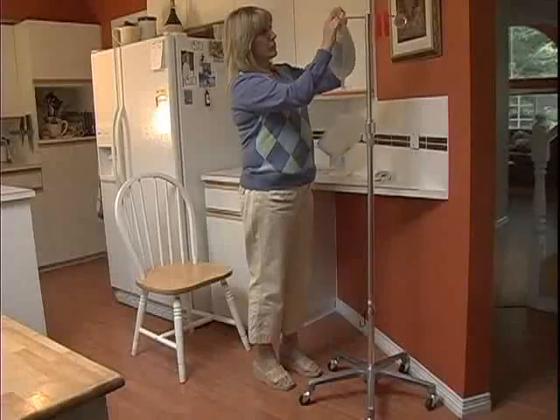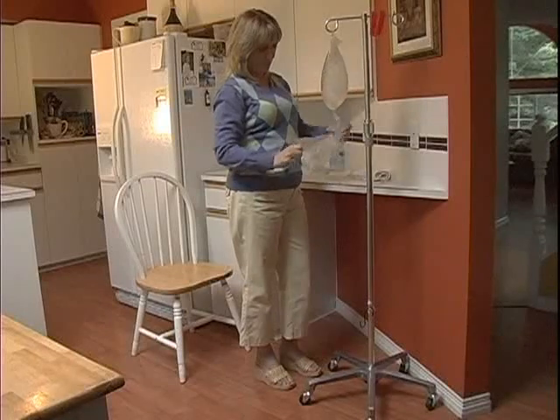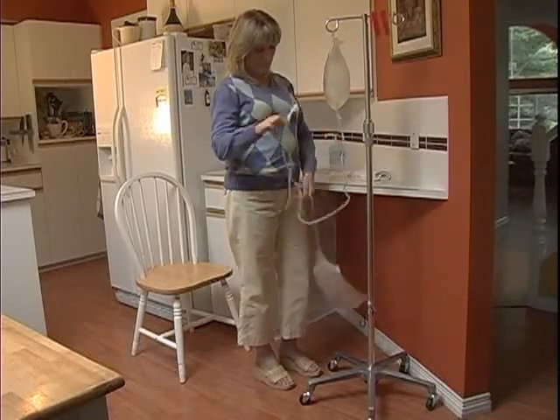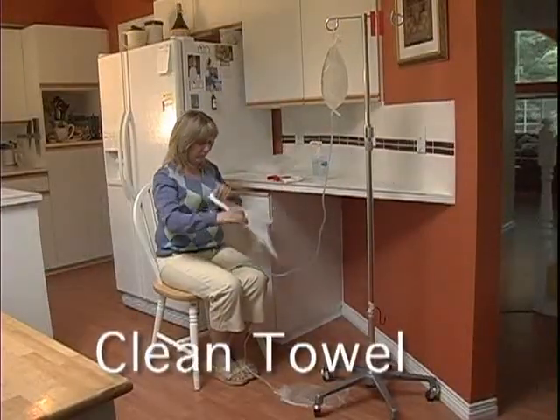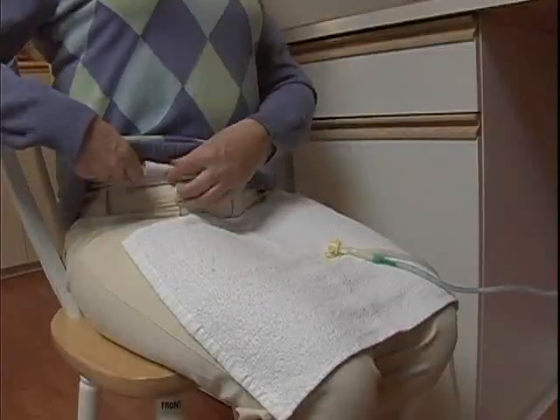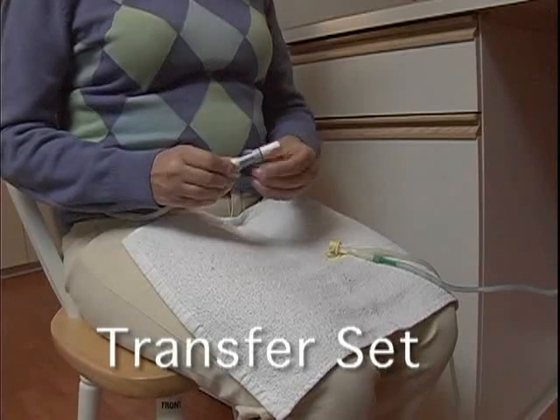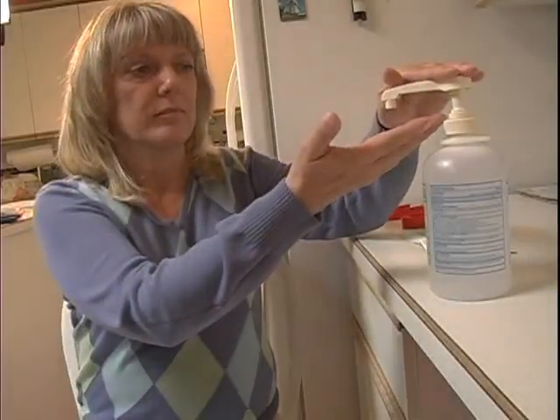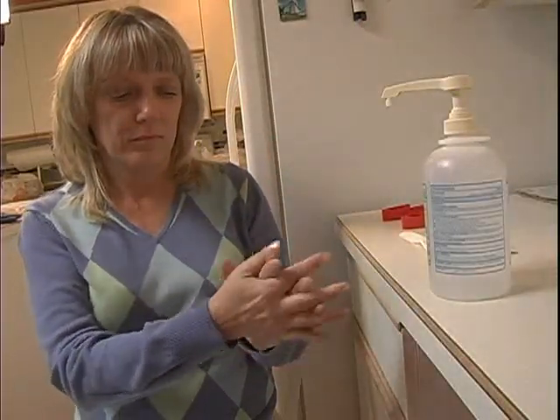Hang the full bag on the top of the IV pole. Put the empty bag on the floor or on the bottom hook of the IV pole. Sit down on a chair next to your supplies and IV pole. Get your transfer set out and place it on the clean towel on your lap. Ensure that the clamp is closed and leave it on your lap. Clean your hands again using hand gel.